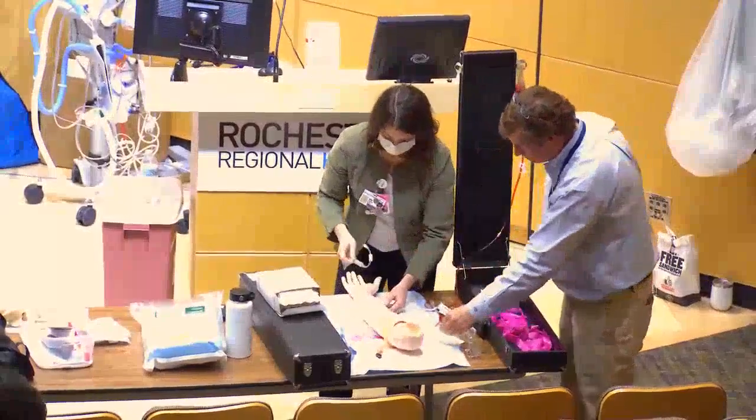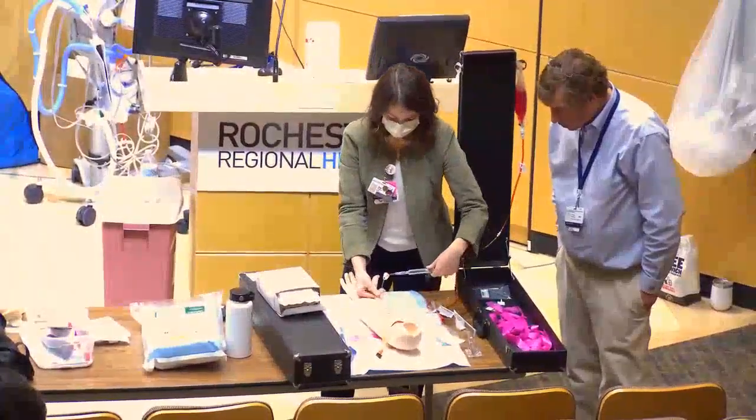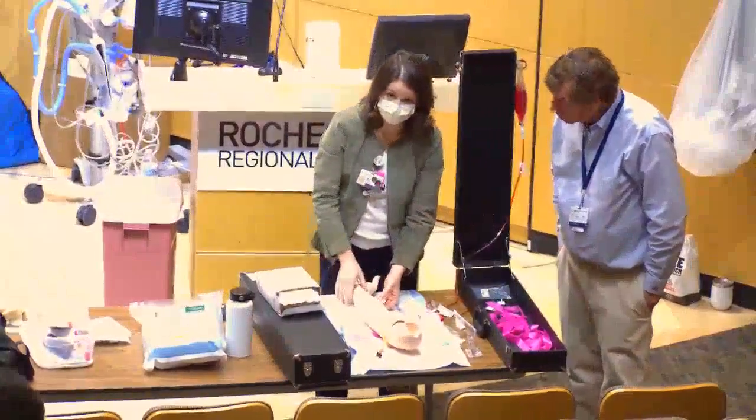Hook up your connector set. You can often aspirate a little blood and then just flush it through. Secure the IV with a tegaderm and that should be good.